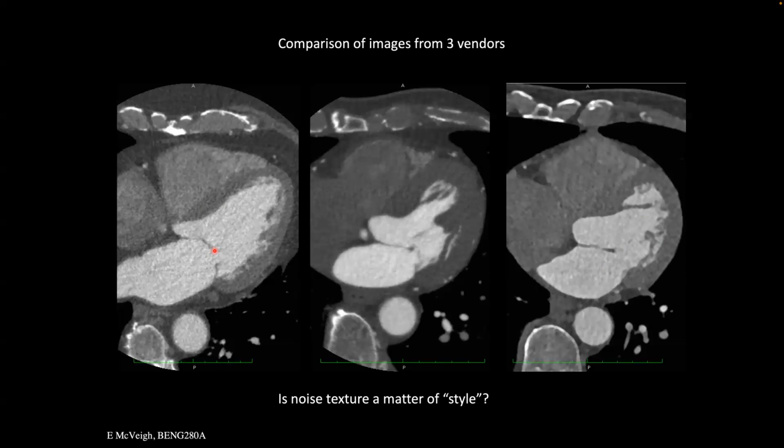Right. So I think this picture is probably the most honest picture on the screen here, in the sense that it's closest to what you would achieve by really good quality imaging plus a standard reconstruction with maybe some kind of smoothing filter, but it doesn't do anything special to the signal.